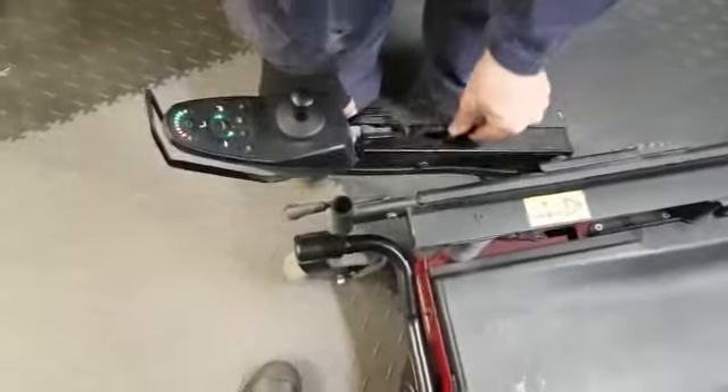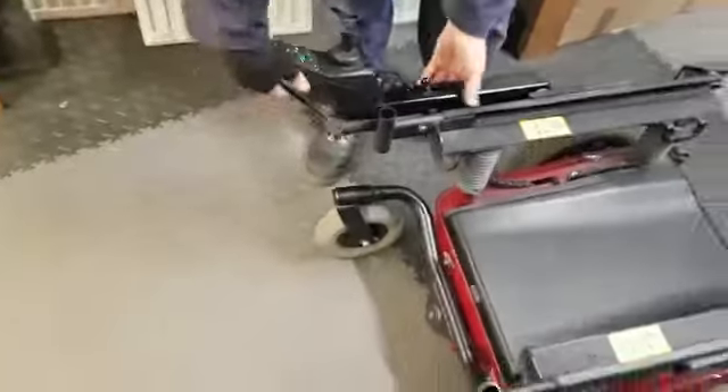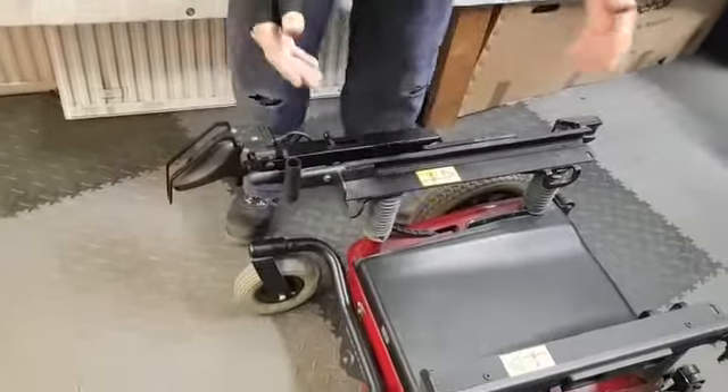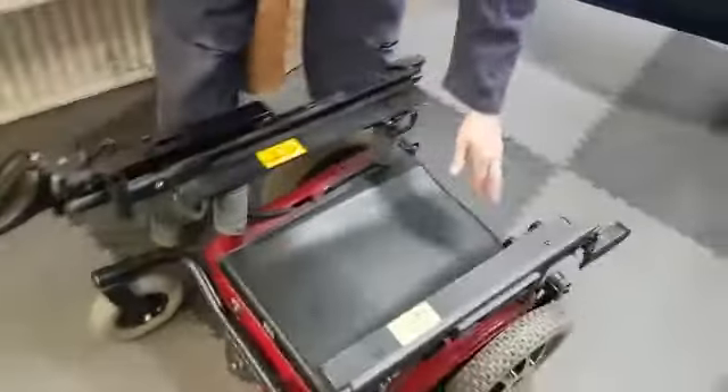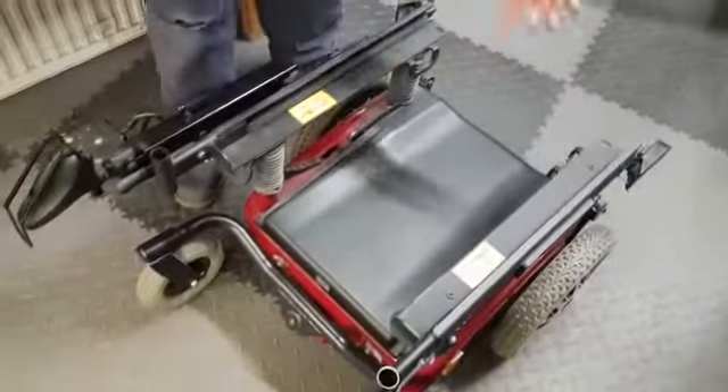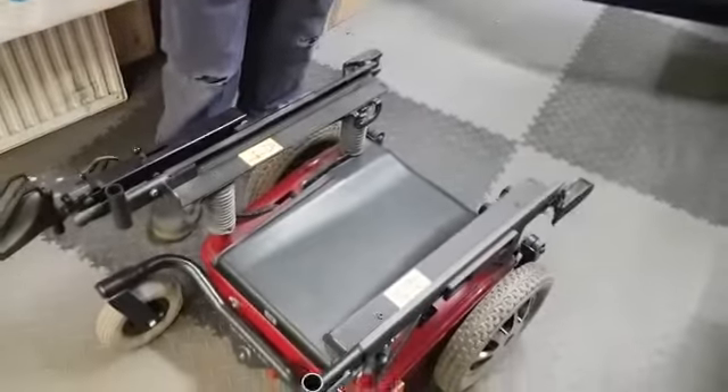This also has a rise and fall, so in a sitting position you can lower that down. This then folds out of the way — there's a specific lift bracket. You've also got the tie-down hooks, so if you're travelling in a taxi or anything like that, you can then just tie the wheelchair down.